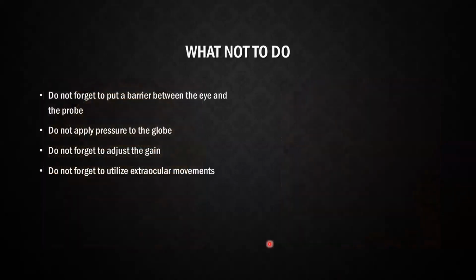So what not to do? Do not forget to put a barrier between the eye and the probe. Think about the ultrasound machines in your department. Would you want that probe directly on your eyelid? For me, that's a hard no. So please put a probe cover on.